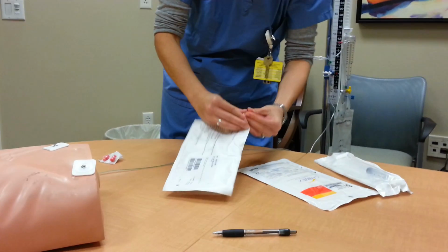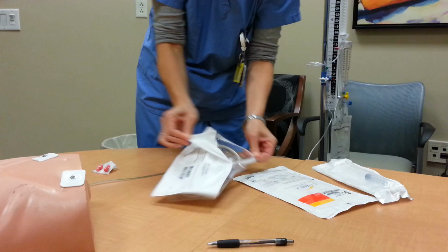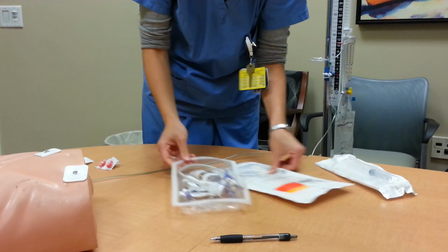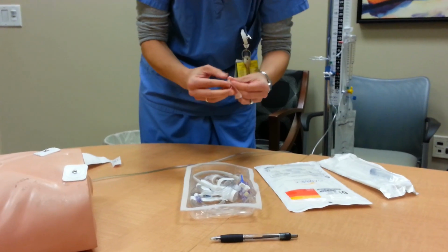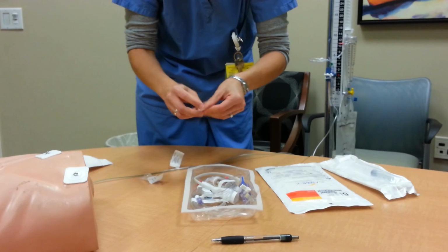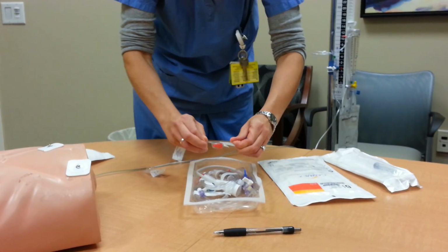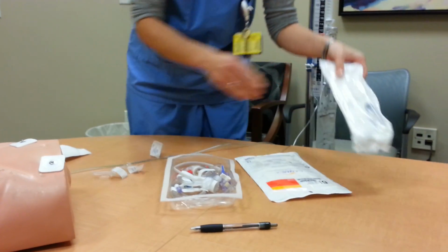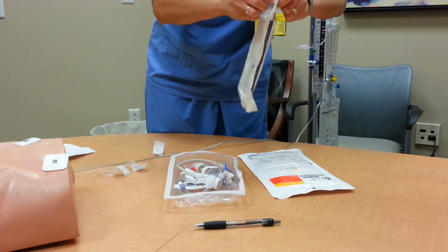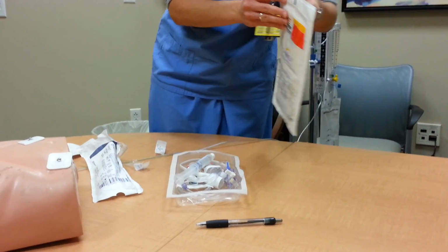You put on a mask, you grab regular transducer tubing just like you would for an arterial line or CVP or any other pressure. You need about 3 dead enders, and I find that the kit typically doesn't come with enough, so I usually drop 3 in here. You're also going to use a sterile saline syringe. This differs from a normal saline syringe in that the outside of the syringe is actually sterile. Open them up, drop it in your tube. You'll put on sterile gloves.